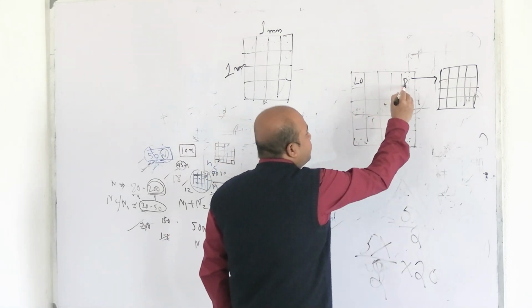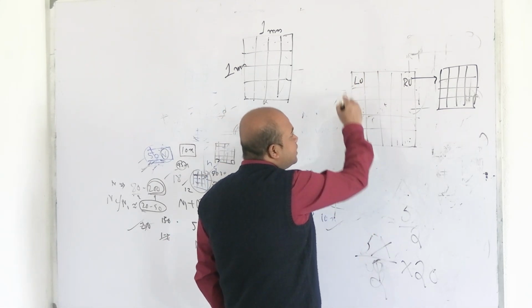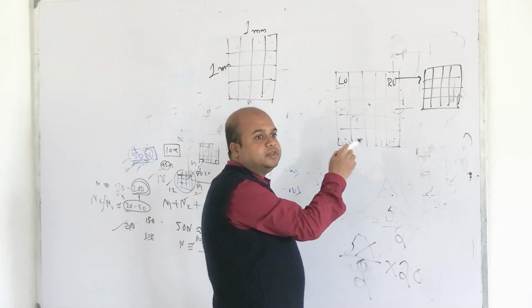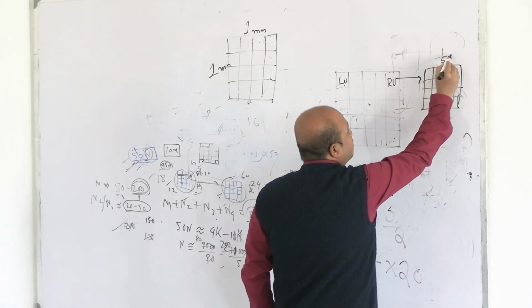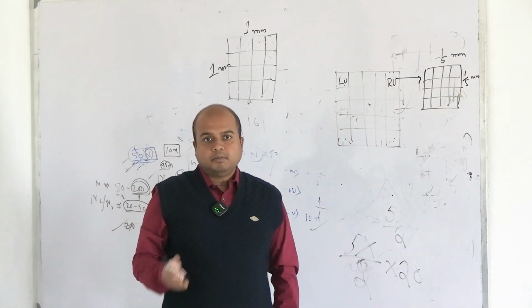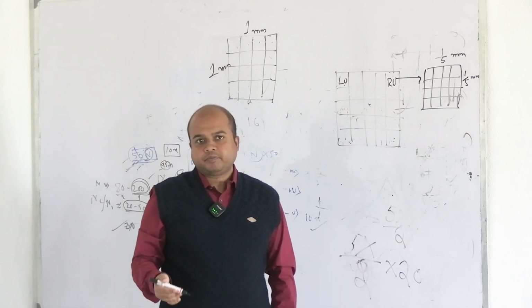Here left upper, right upper, in case of the central RBC square, among that the left upper medium RBC square, right upper medium, which we are calling the medium, this square which has dimension of, and don't write 0.2, you will again confuse. Arithmetic calculation is better done with fractions.